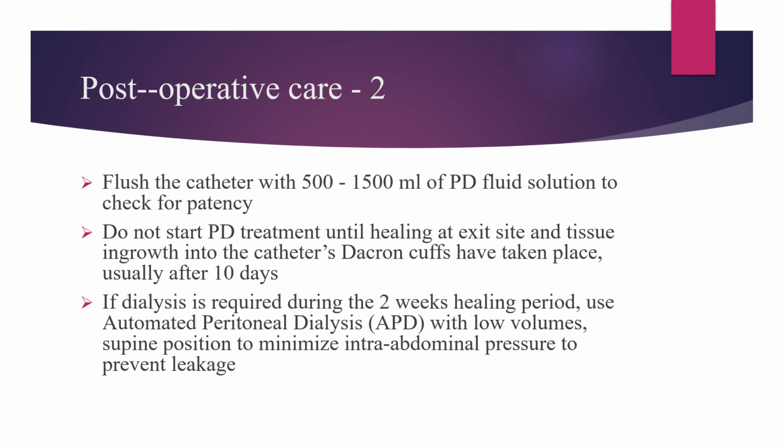Don't start PD treatment until healing at the exit site and tissue ingrowth into the catheter's Dacron cuff have taken place, which usually needs 10 days. If dialysis is required during this healing period, use automated peritoneal dialysis with low volumes in the supine position to minimize intra-abdominal pressure and prevent leakage.